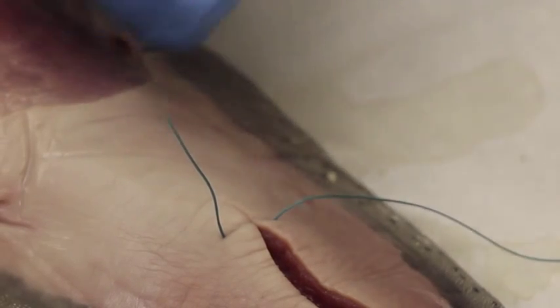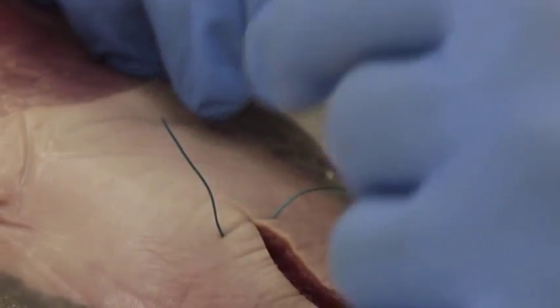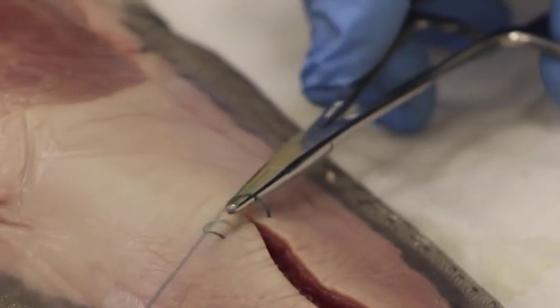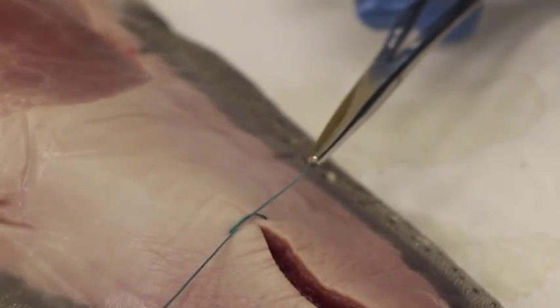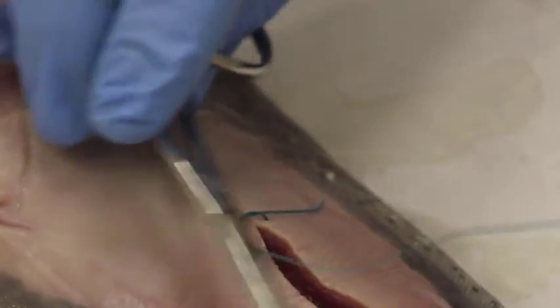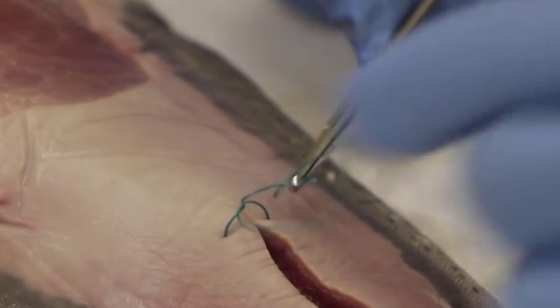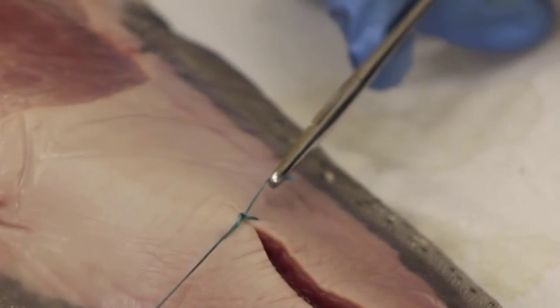What you do is put the driver in between, wrap only once — not twice — grab the tip, and pull away from you like you normally do. Then again grab it once, grab the tip, and pull in the same direction as before.